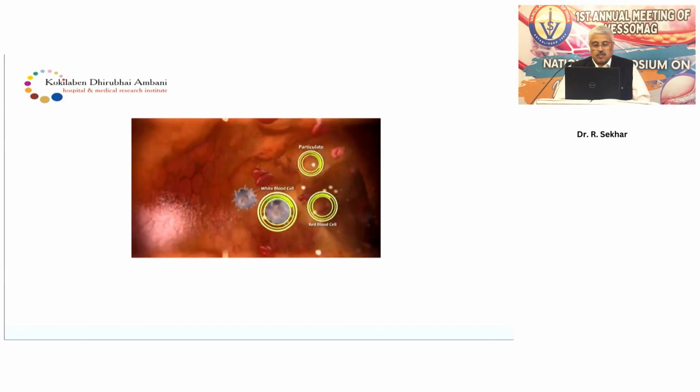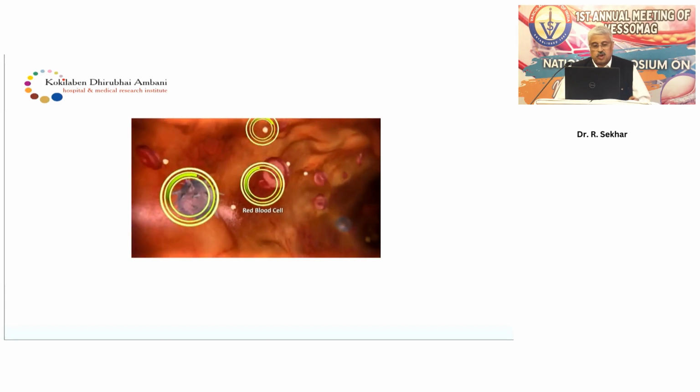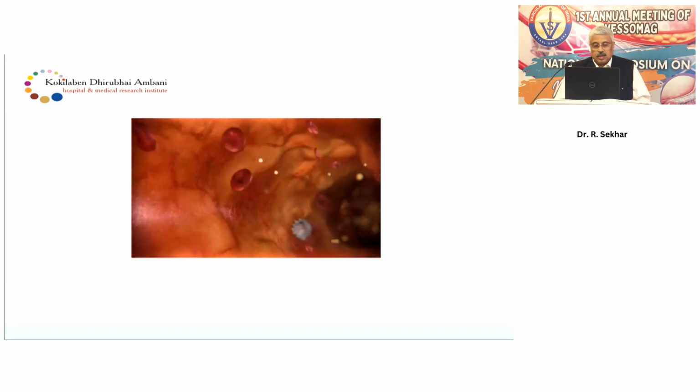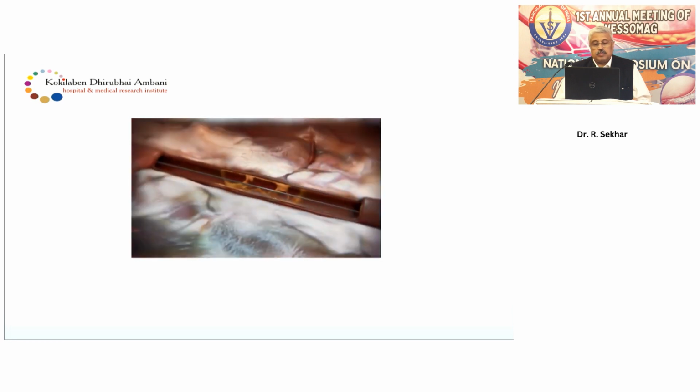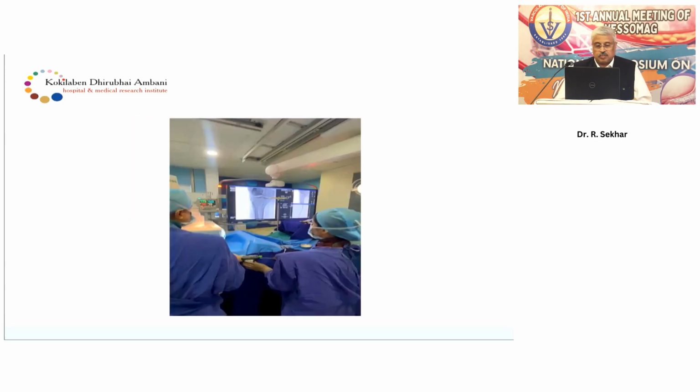What they say is that the particles that come out are very, very small, so you really don't need a filter. I'm not too sure about it, but that is why I prefer it only for short segment lesions, so I don't anticipate too much muck.